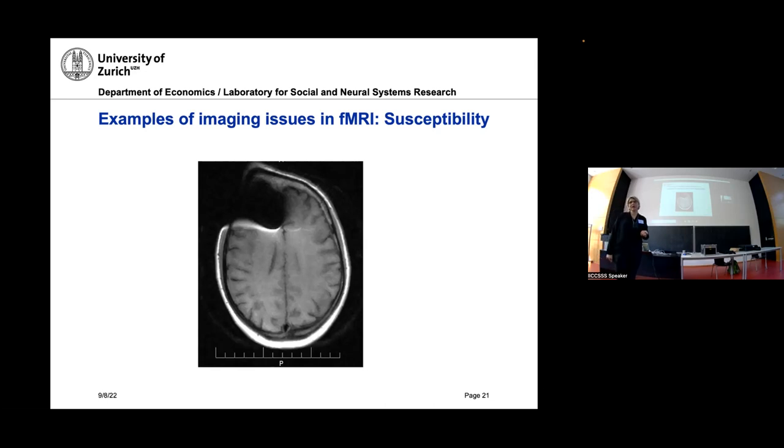So in a good lab, of course, you would look at that, but I've seen already lab people acquiring data, overseeing things like that. So normally that's the best thing, at least for this, because this is totally useless data, right? So you can stop the experiment here, and if you acquire the participant, it's a waste of money and lifetime.